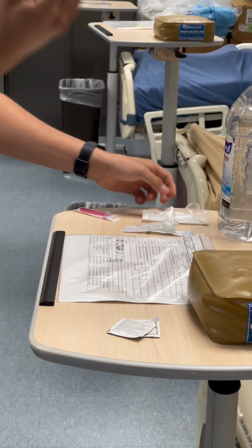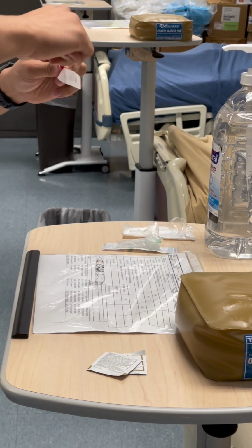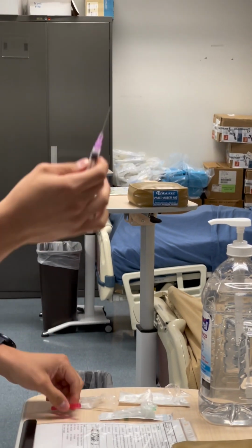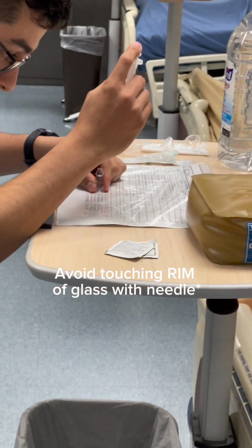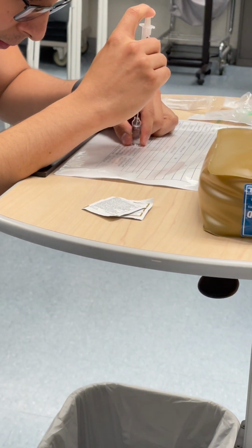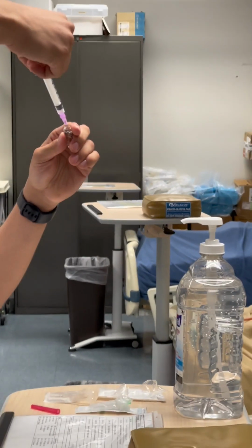Now I'm going to get my 1 to 3 milliliter syringe and my filter needle. I'm not going to draw any air for this medication. I'm going to avoid touching any glass. Going to go straight through the middle. Perfect. And I'm drawing 1 ml of Compazine.